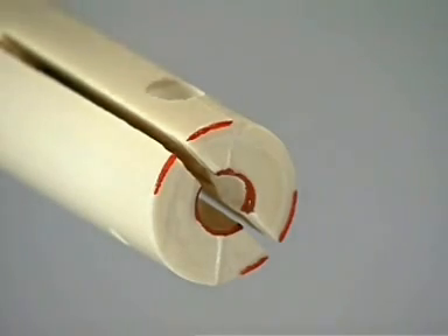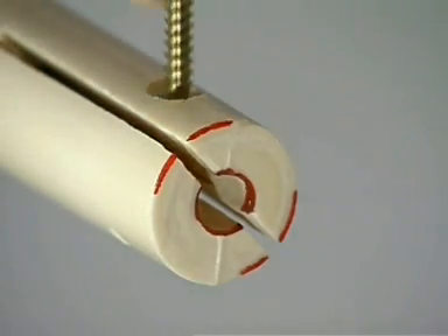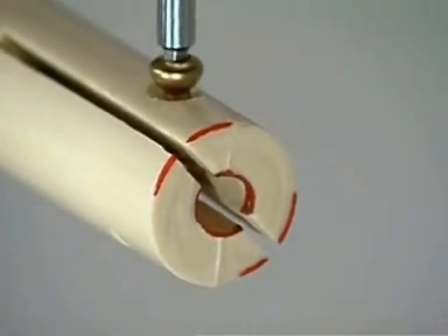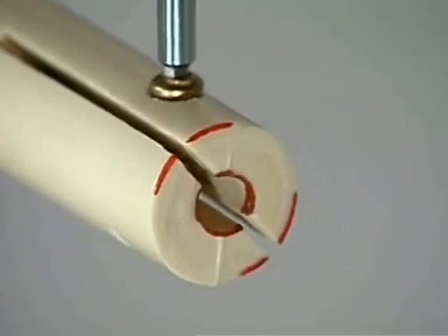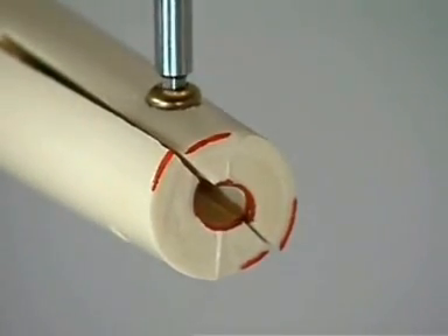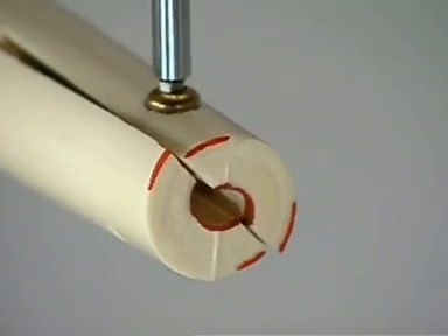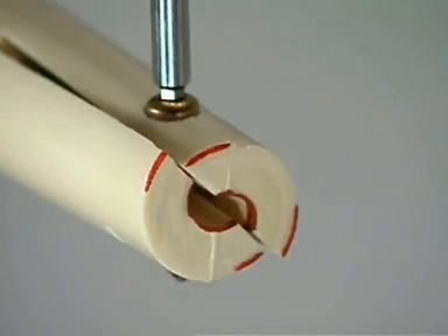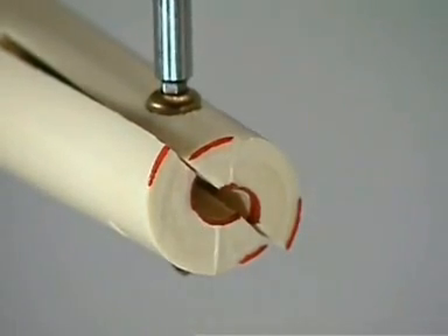The screw is removed and the bone model rotated. A lag screw is inserted as before. The only exception is the orientation of the lag screw relative to the fracture plane. When the lag screw is not placed perpendicular to the fracture plane, shear forces develop. They can cause displacement of the fracture fragments, as shown in this demonstration.